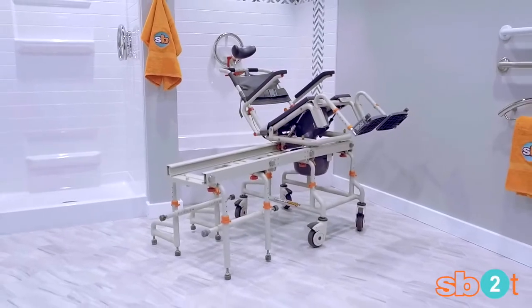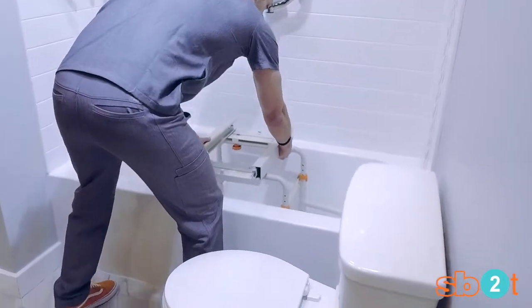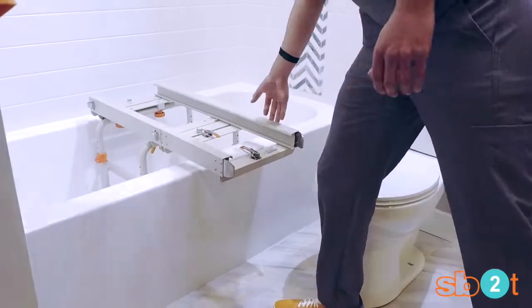The SB2T TubBuddy with Tilt Tub Transfer System. Convert your bathtub into an accessible bathtub without the cost of an expensive remodel.